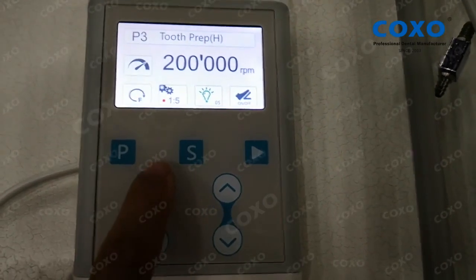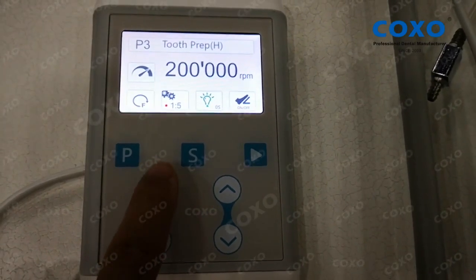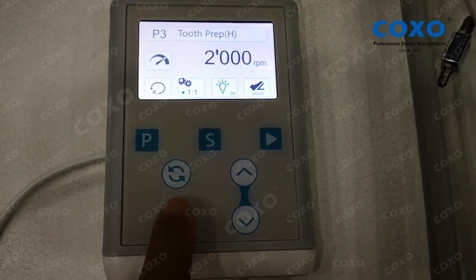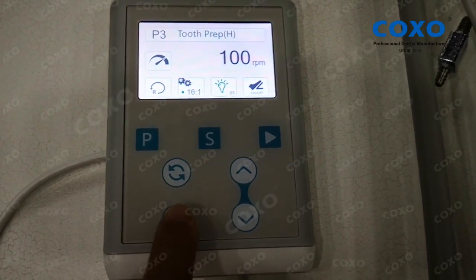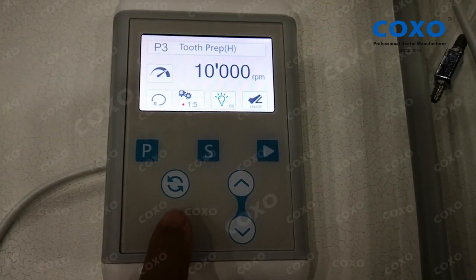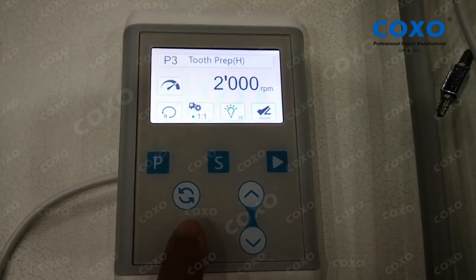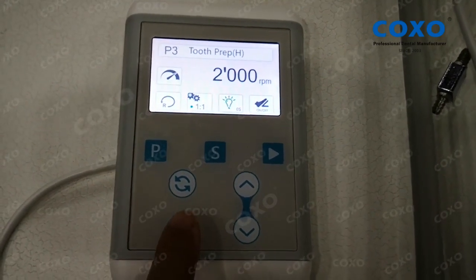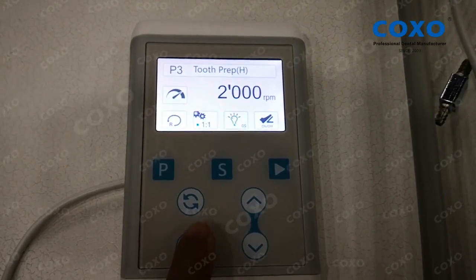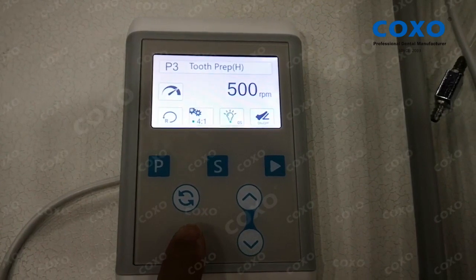You can use this button to change the forward or reverse. This button is to change the gears — it controls the angle you use to increase or reduce speed. If you use a different contraangle, you must choose the right gears.